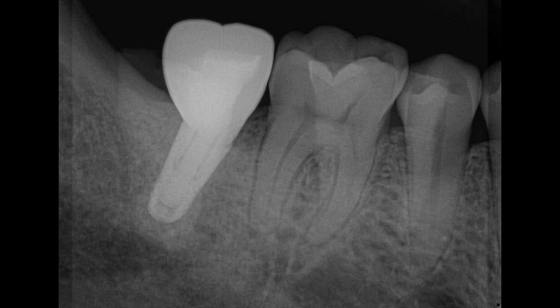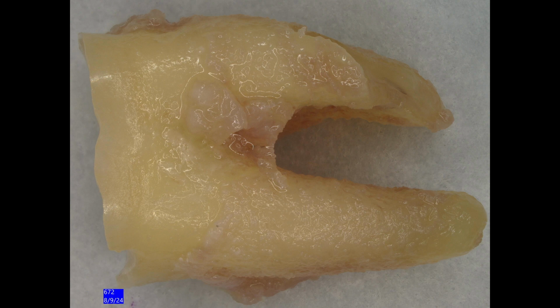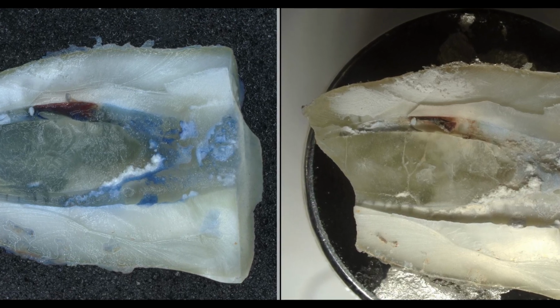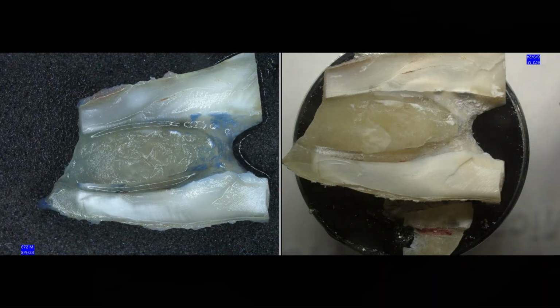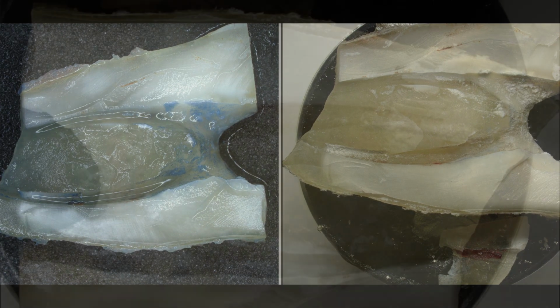As you recall, this is the tooth that he did, and these are my radiographs when I got the tooth. The root tip was fractured on the mesial root. And then we sectioned it sagittally. This is one half of the sagittal section, and you can see there's quite a bit of pulp still present in the root. The other side of the sagittal split looked fairly clean. But even in looking at this, it's hard to tell where you should really look.